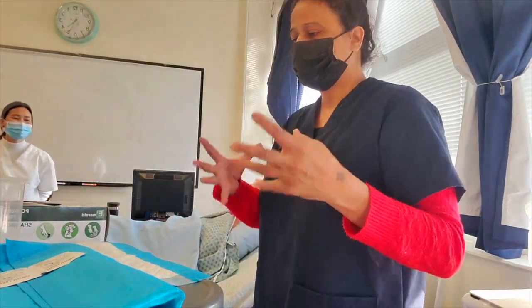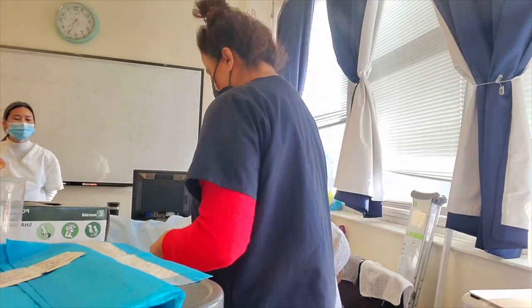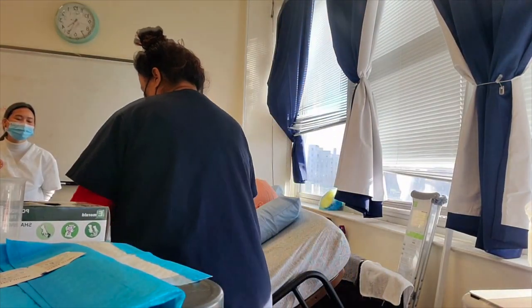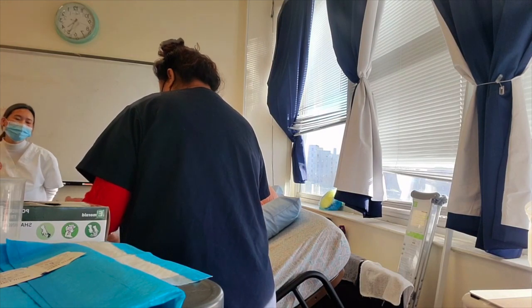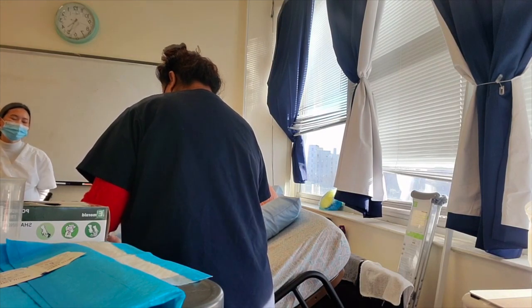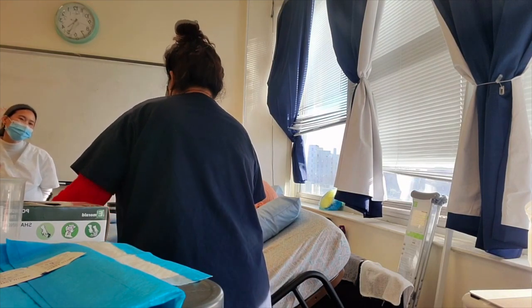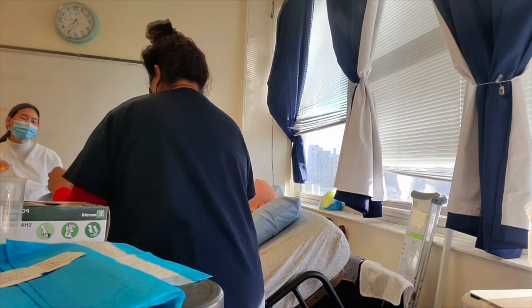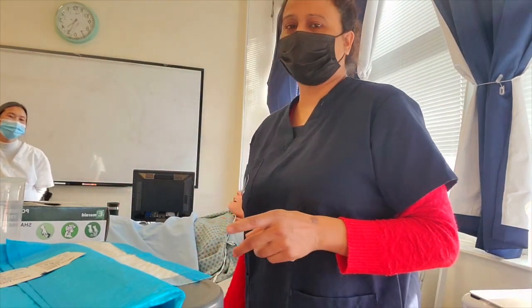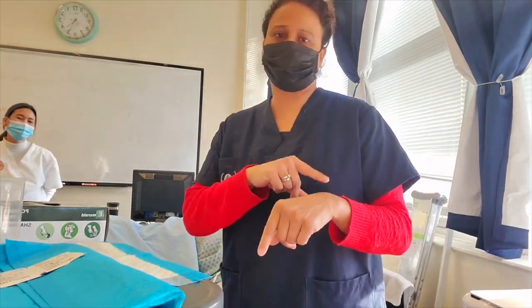When you come back in, you check the patient's ID: 'Hi Mrs. Jones, how are you? What is your date of birth?' I did my two identifiers — I got her date of birth and checked her ID band to make sure she's the correct patient.